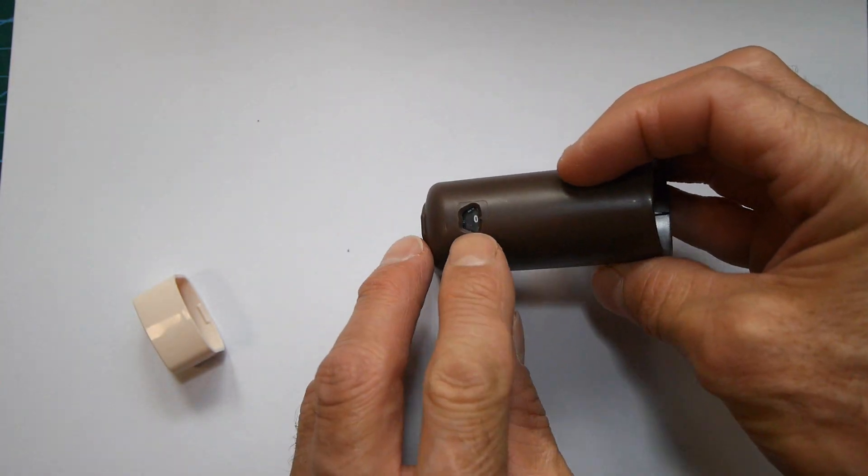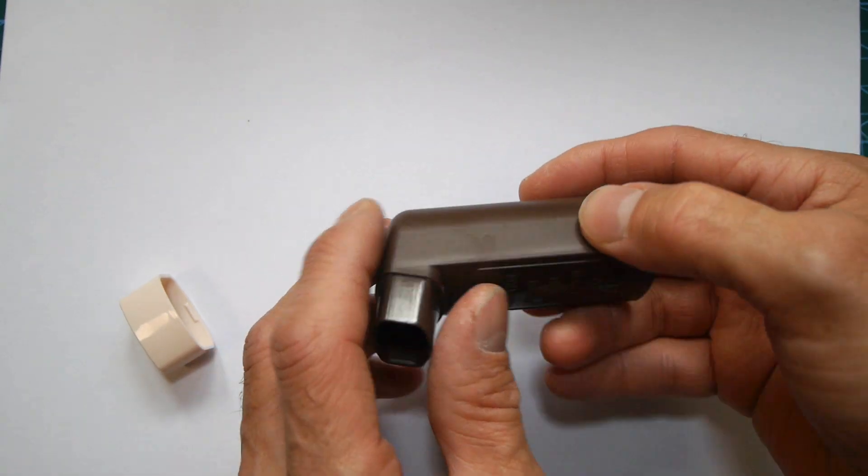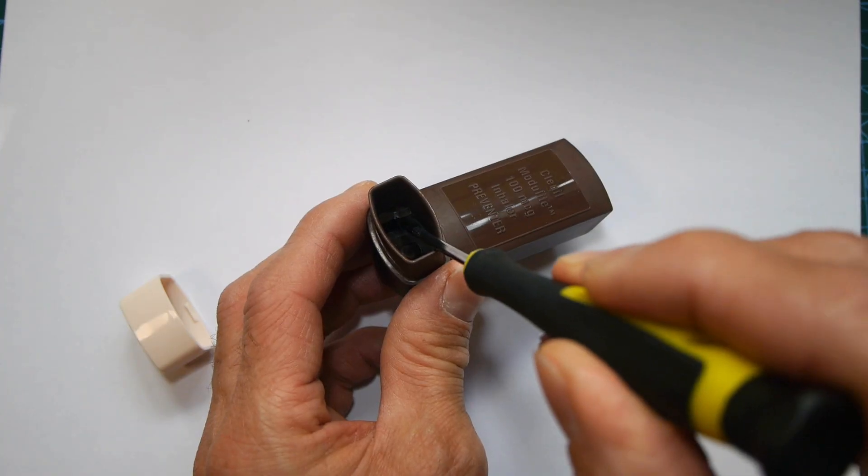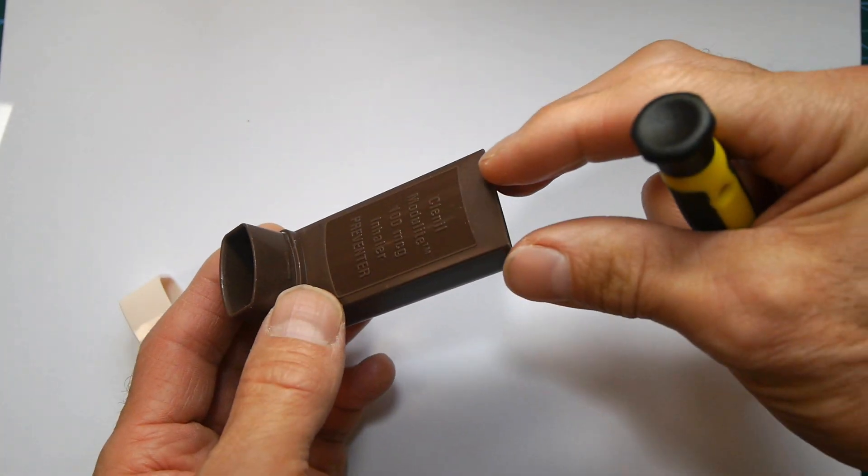It also contains the counter mechanism and so it's white but the counter wheel is actually black. To get that out I've got to get a screwdriver in here and just flick a couple of tabs inside that will release the mechanism and then it'll come out this way.